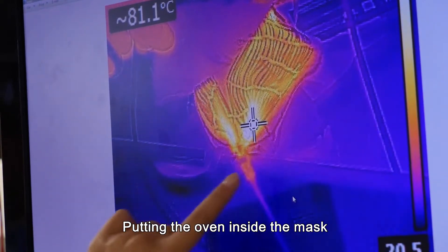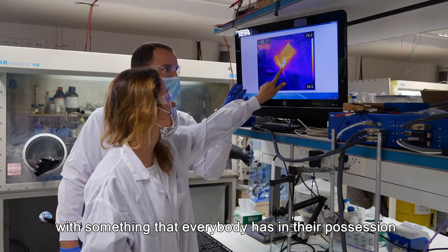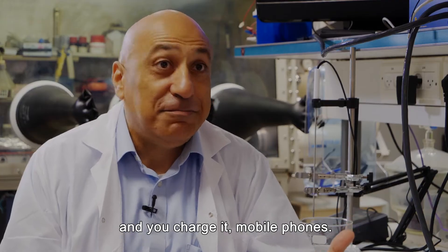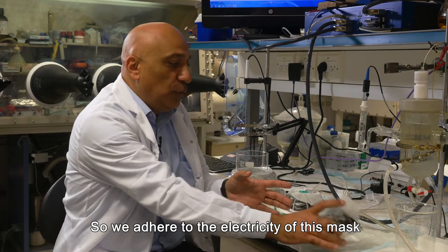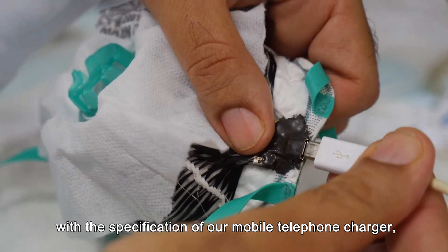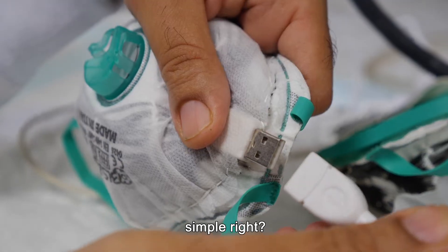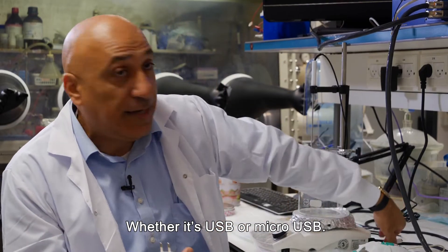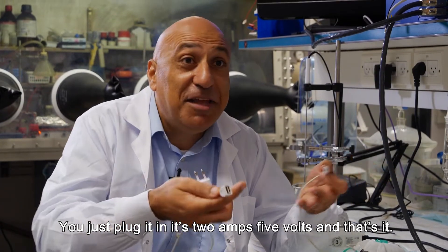Putting the oven inside the mask would mean that I will need to heat it up with something that everybody has. What do you have in your possession that you charge with? Mobile phones. So we adhere to the electricity of this mask with the specification of our mobile telephone charger. Whether it's USB or micro USB, you just plug it in — it's 2 amps, 5 volts, and that's it.